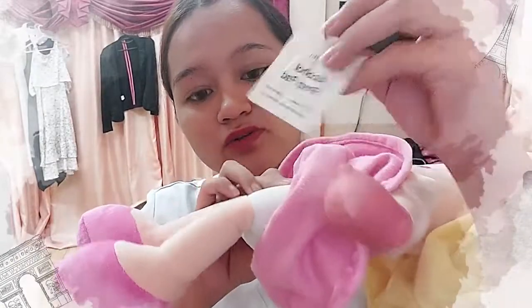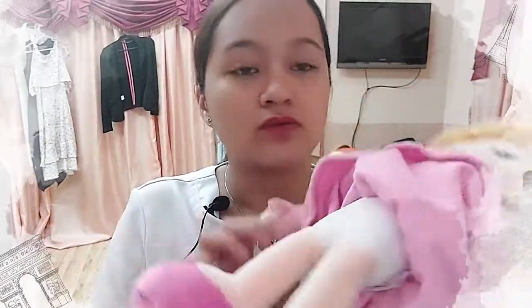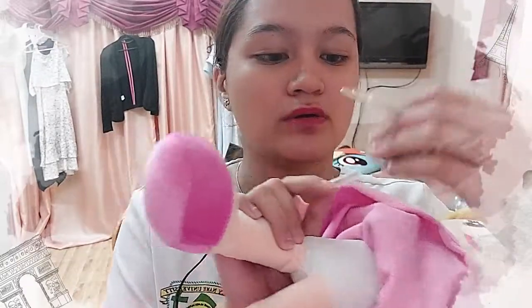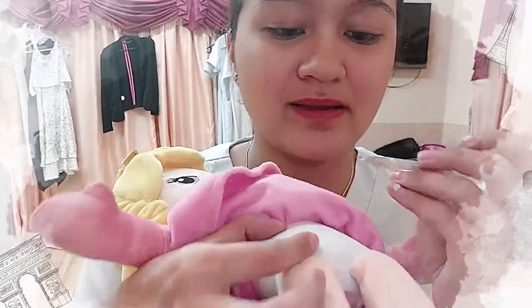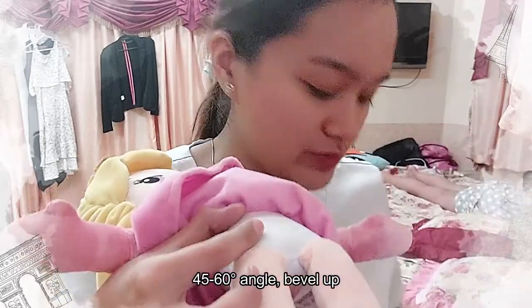I need to locate the injection site, which is two inches away from the umbilical area at the abdomen. Disinfect using an alcohol swab in an inner to outer circular motion. Use an injection site that hasn't been injected yet. Pinch the injection site and jab at a 45 degree angle. But if the client has more adipose tissue, use a 90 degree angle. Instill the medication, then release. Discard the uncapped needle in the sharps container and do aftercare for the patient. Document all relevant nursing assessment information.